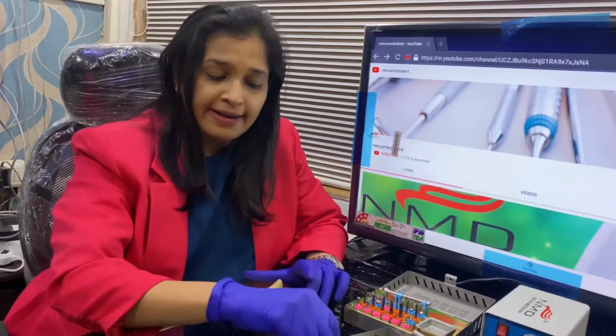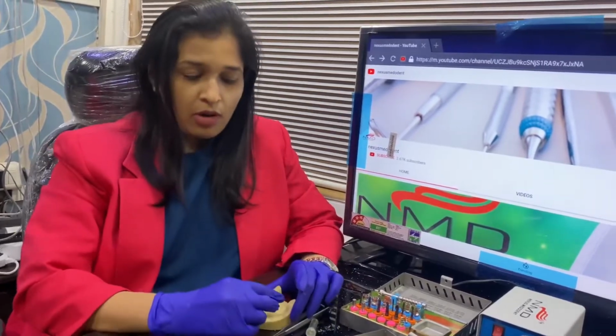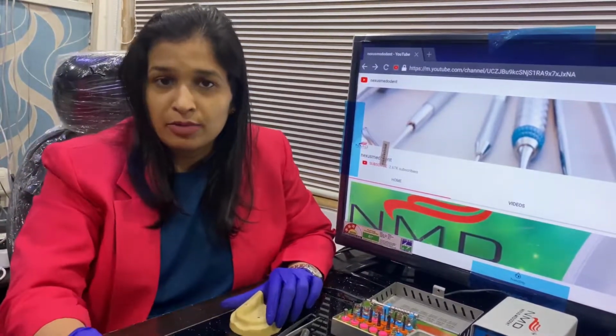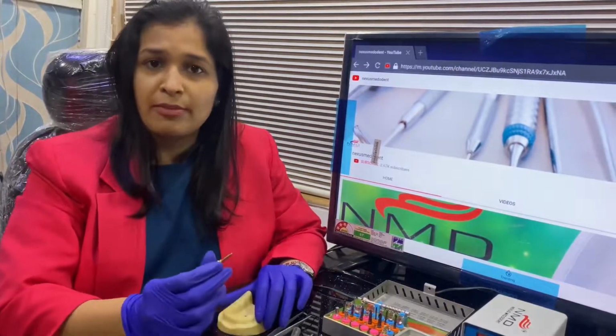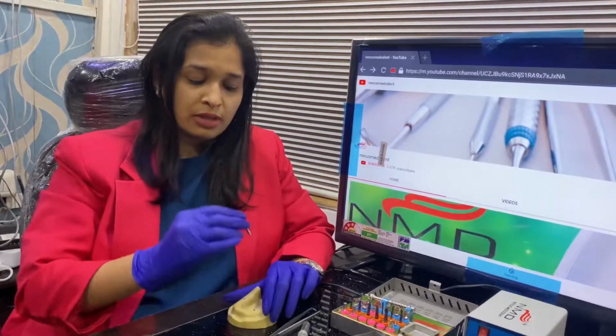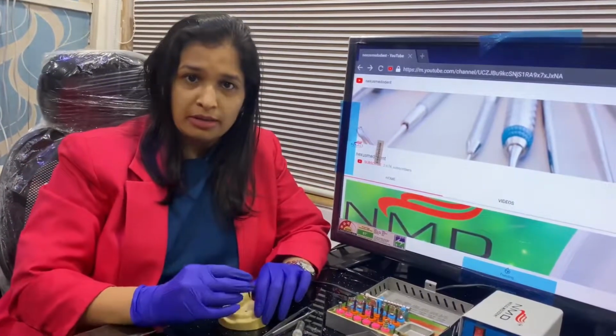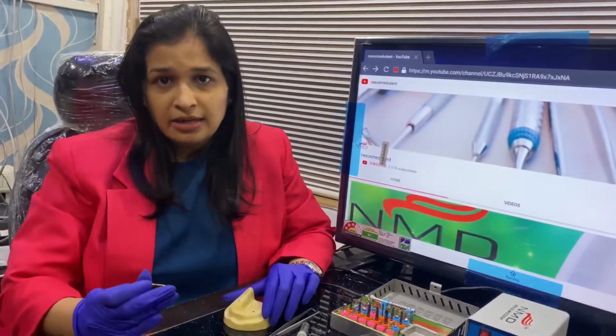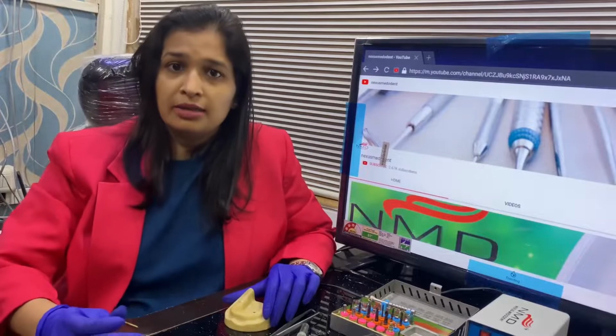Then again take your expanders or the drill which corresponds to the implant that you're placing. Supposedly in this case I'm placing a 3.5. Usually this happens when you've not drilled to enough length. So what you do is, again place your expanders, go to that correct length, and then take an X-ray to reconfirm that you've reached that length, and then take the implant and place it back.